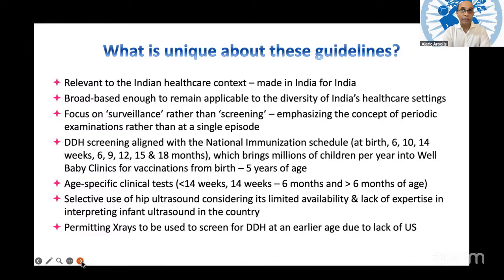And more importantly, the last point is that we have lowered the age for when an X-ray can be done. Traditionally, we used to wait for 6 months of age before we would recommend an X-ray. Therefore, this created a gap in the treatment. They would say that the ultrasound is available to around 3 or 4 months of age, so the ossific nucleus starts appearing. And then because we don't have access or the expertise in interpreting ultrasound, we lose those children for follow-up till they come back at 6 months of age when we would recommend an X-ray. And we're no longer doing that.